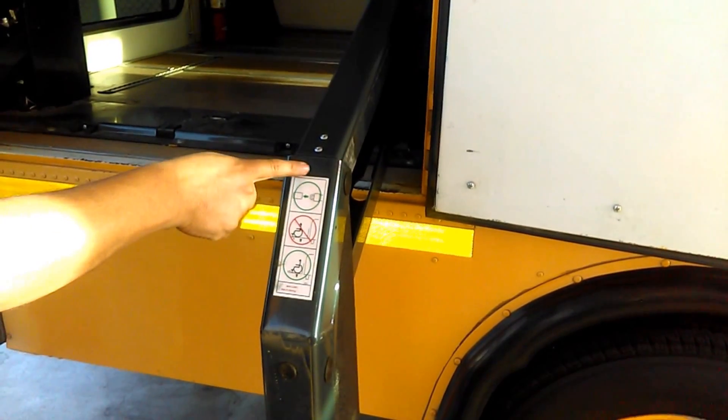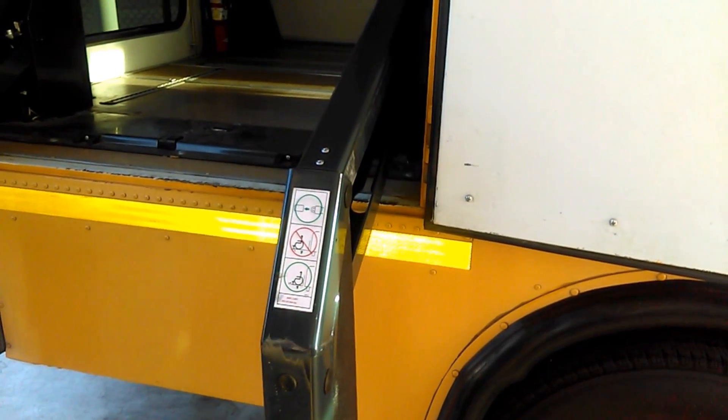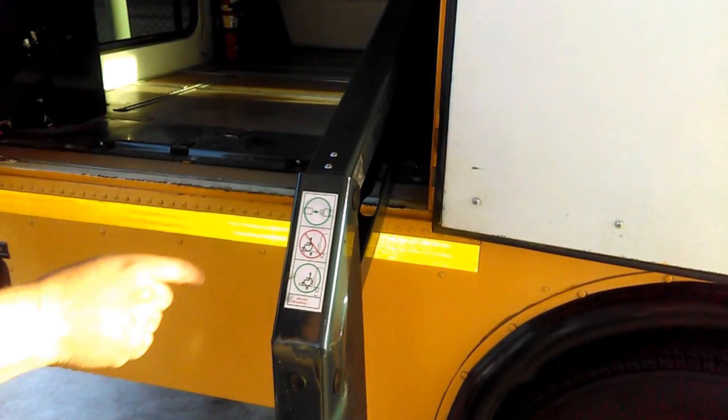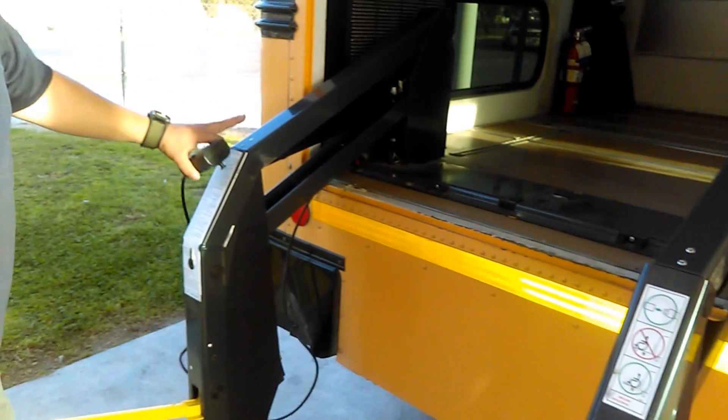I also have a sticker stating the max load, which says 800 pounds. It also tells you that you're supposed to use the seat belt on the wheelchair lift and how to properly face the wheelchair — facing away from the bus, not towards the bus.